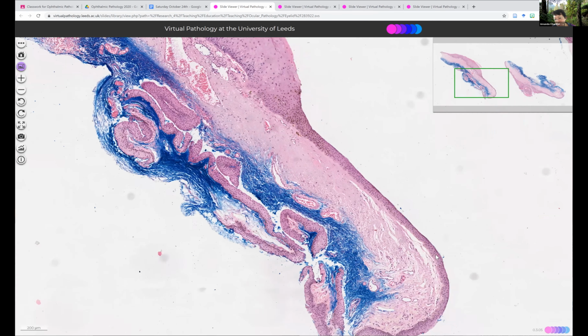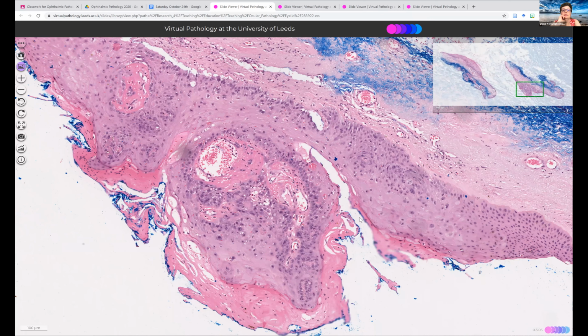And just on my right-hand side of the papilla, down here. Yeah, just there. It's quite thin and it looks like it's going into high grade, doesn't it? Up here. Yeah, so I think this lesion shows a variety of degrees of dysplasia, ranging from low grade in that other piece through to high grade just there.